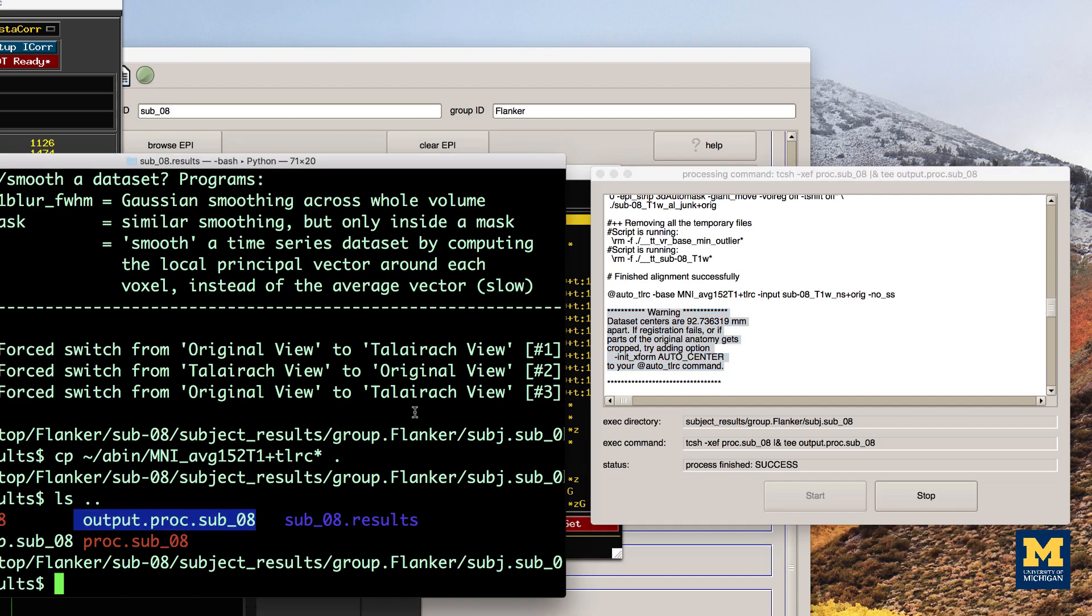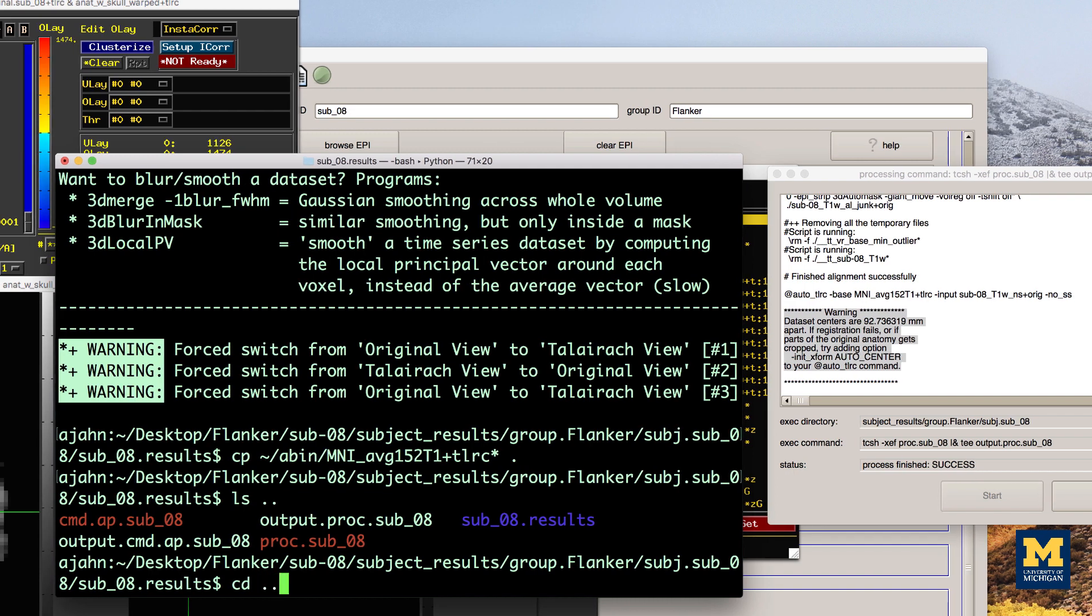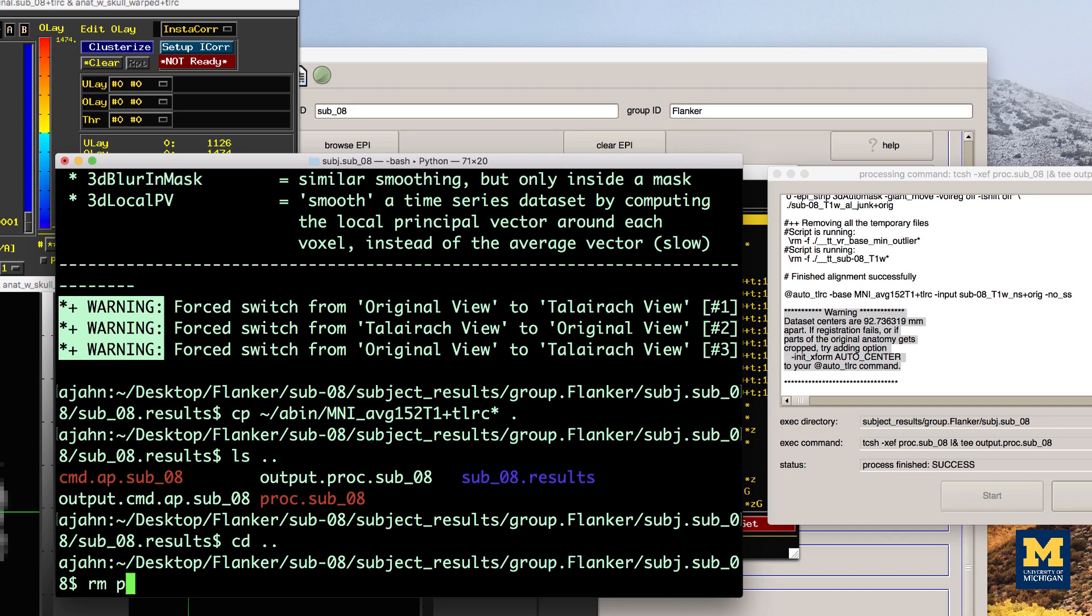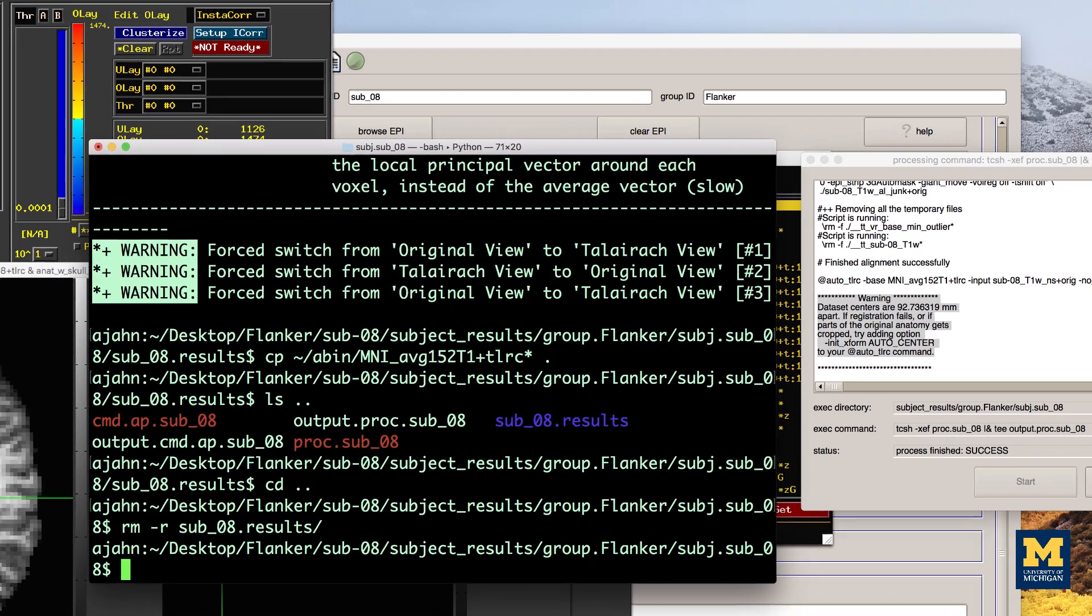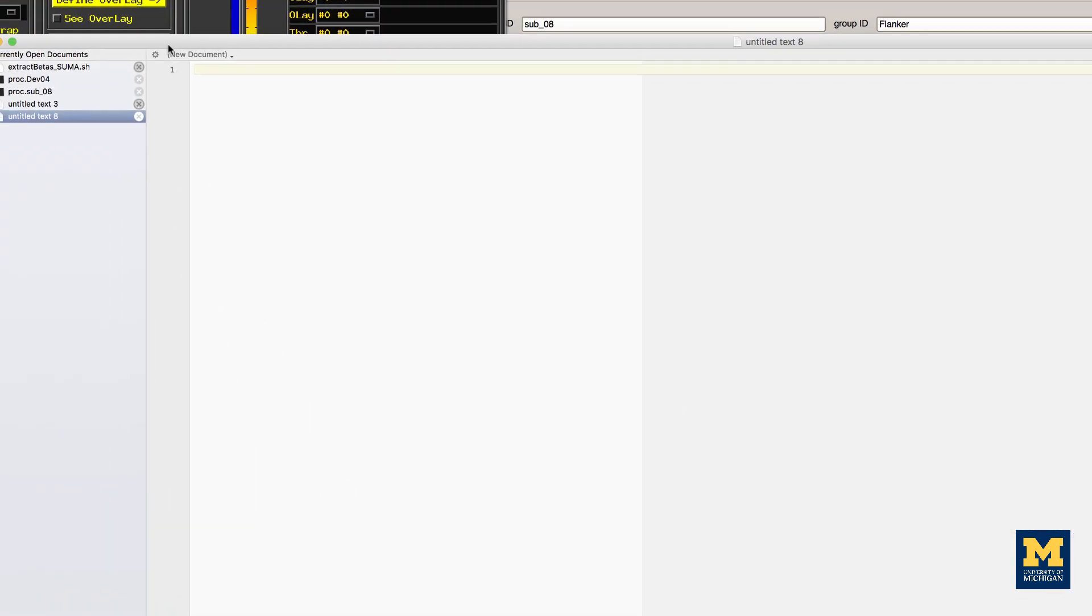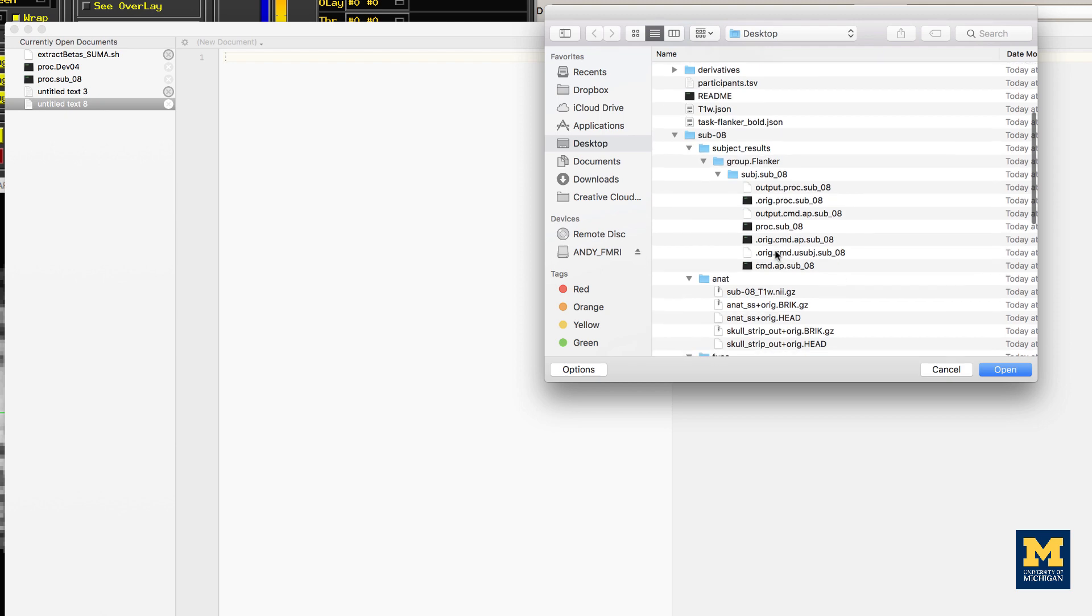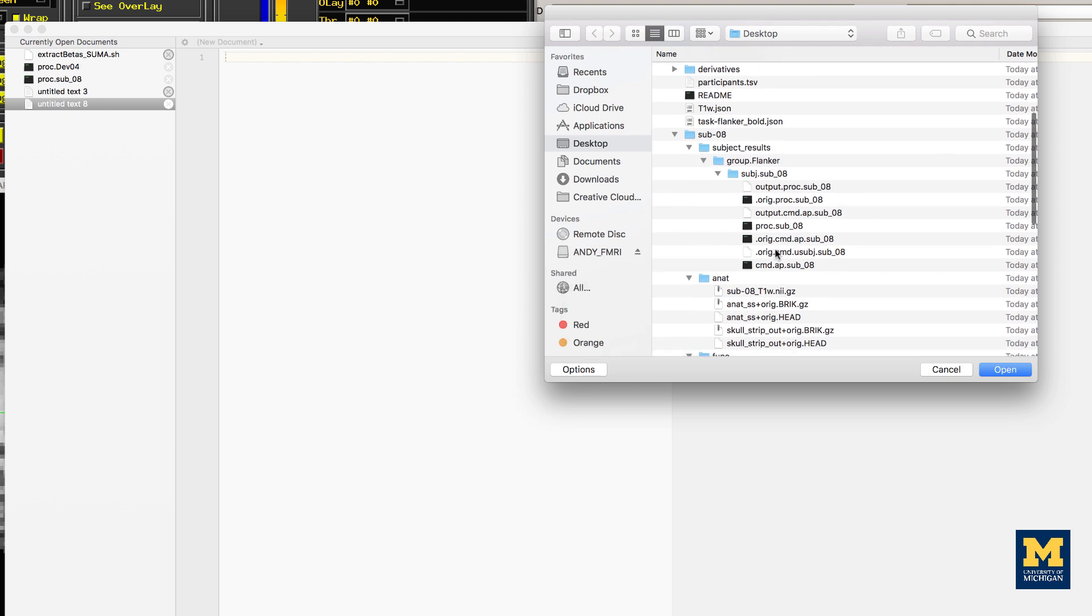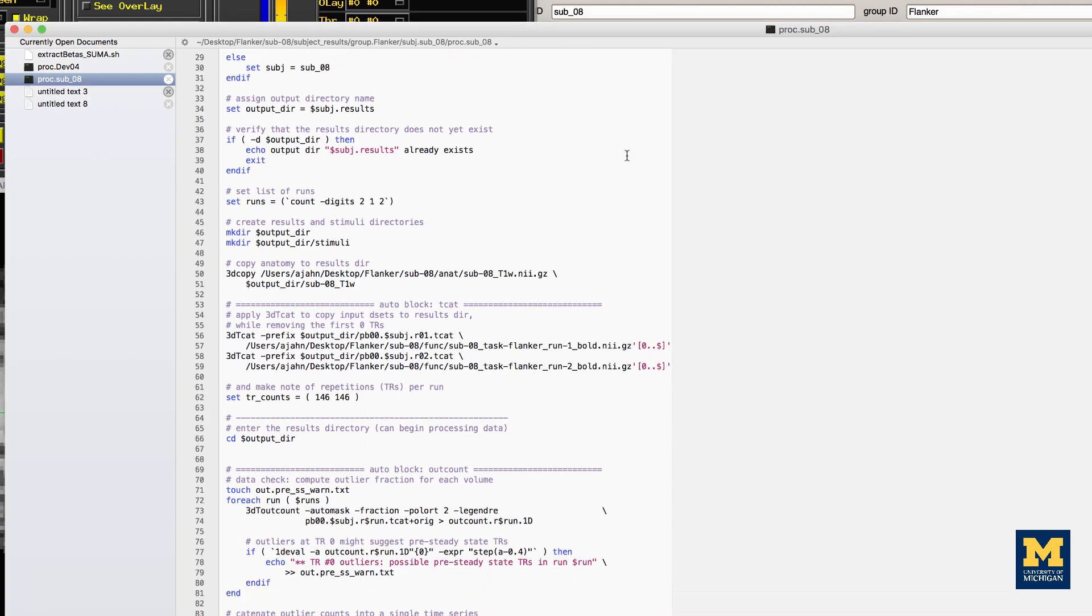We can do so by navigating to one directory above the preprocessing directory, removing that preprocessing directory, and then editing the file proc.sub08 to include the string -init_xform AUTO_CENTER after the auto_tlrc command, which should be in line 119 of your proc file.